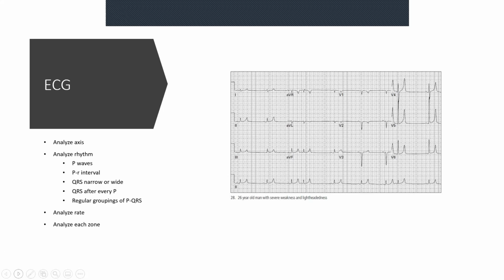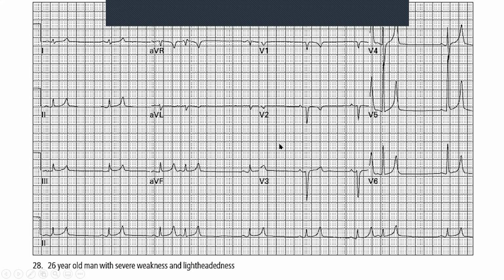So the first thing that will strike you is that it is an obvious bradycardia, but we'll get into it now. As usual, let's just follow our system so that we know what's going on. If you look at the axis, lead 1 is biphasic and lead AVF is positive. So it's starting to trend towards a right-sided axis, a normal to right-sided axis. It's sitting more or less on the boundary of that, but still keeps it within normal.